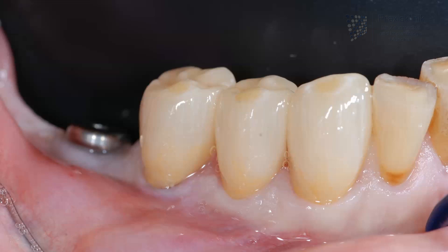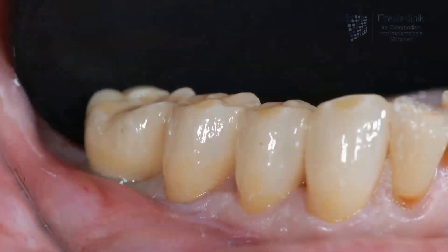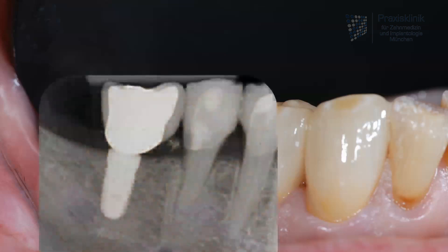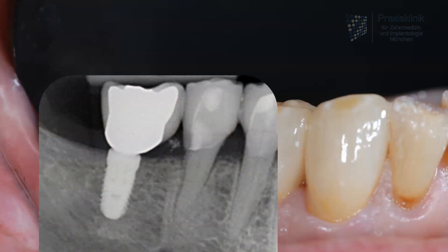This picture shows the same situation intraorally after having inserted the single crowns supported by the natural teeth. In the next step the implant supported crown is inserted and after that screw retained with a recommended torque. The X-ray image informs us about the relationship between the implant body and the crown.